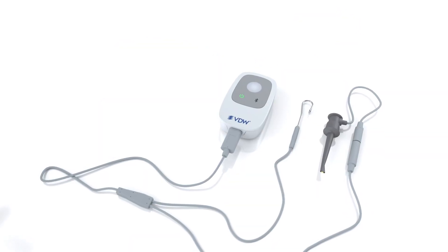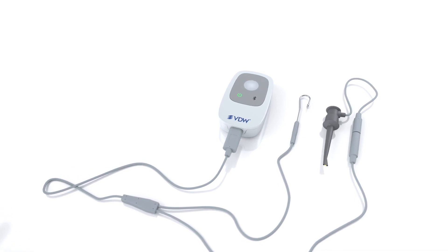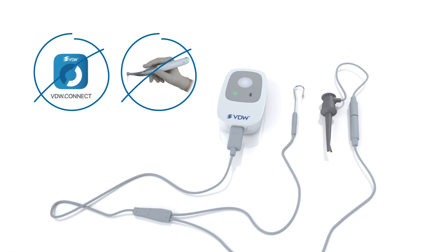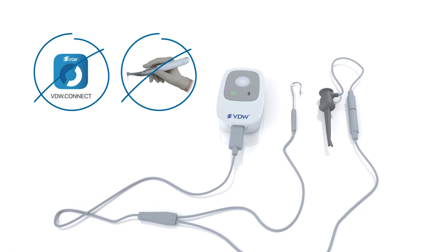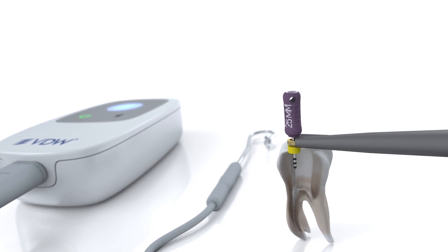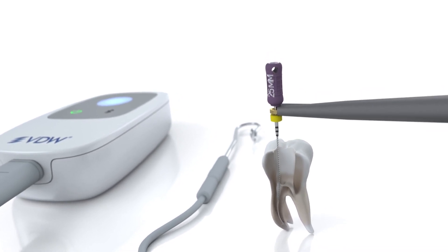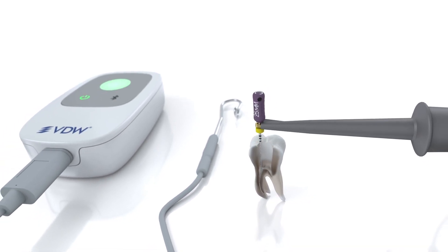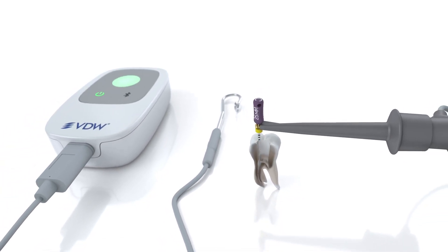The device is now ready to be used in standalone mode without being connected to the Connect app or being combined with the VDW Connect Drive. When the VDW Connect Locate is used in standalone mode, blue, green blinking, steady green and red blinking LED lights appear on the device itself depending on where you are in the canal.